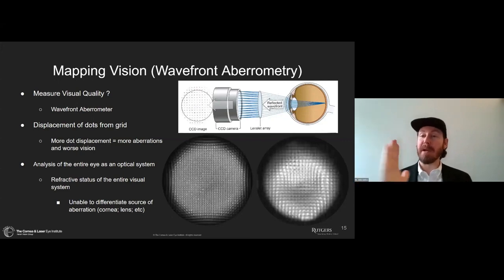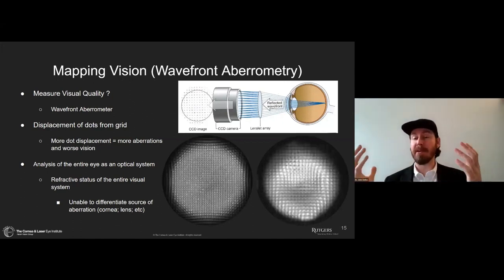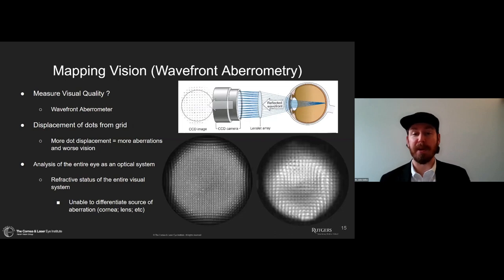With a retinoscope, we're able to see the reflection of the light coming back out of the eye. And if we see deviations in the pupil, like what we might see on a patient with keratoconus, we can say, oh, that's abnormal, right? Well, this is doing it objectively and being able to quantify that with the micron measurements that we talked about before. So we can look at this a couple different ways.